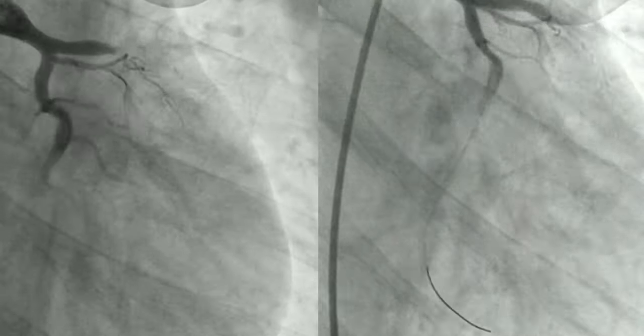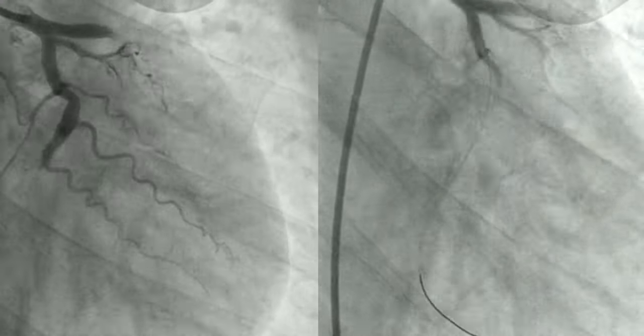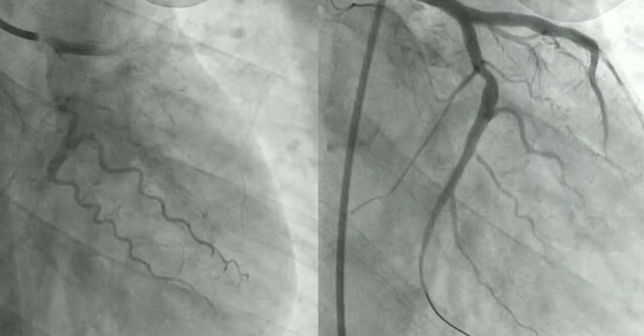As we've spoken about previously, an angiogram is an x-ray test whereby we inject some dye through the arteries around the heart and they are visualised on the x-ray machine. Previously, we used to perform this via accessing the femoral artery or the artery in the groin, but most often nowadays the procedure can be performed via the artery in the wrist.